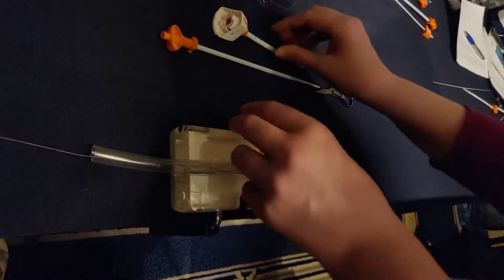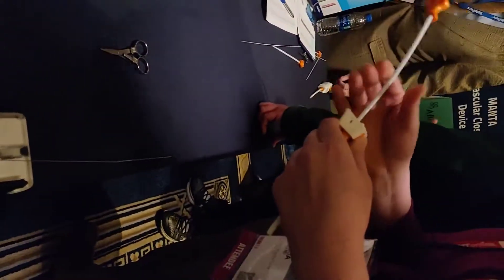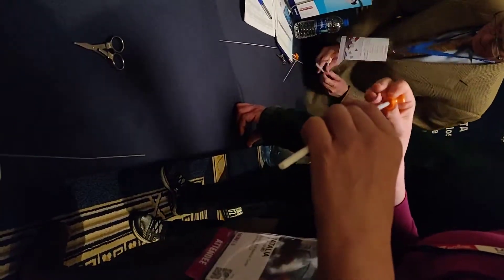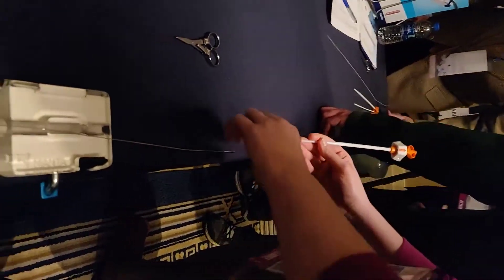Now you do your case. We're gonna shoot that later. You insert that, so again it's a quarter turn. We want that flat part up. Yep, there you go. Perfect. Let's load our water.